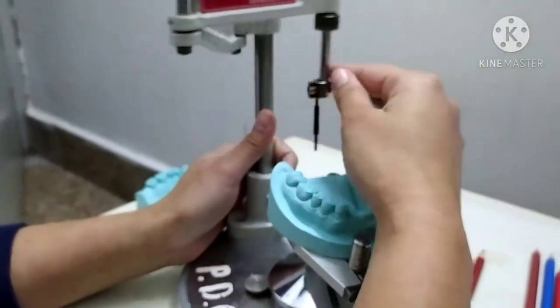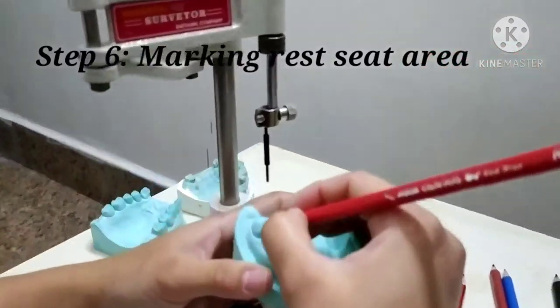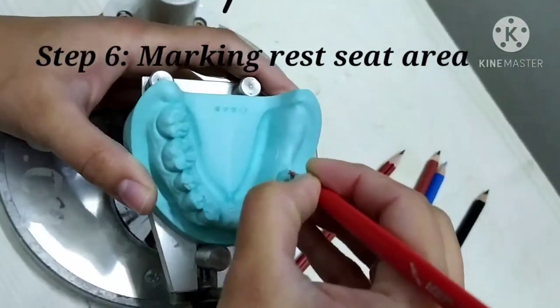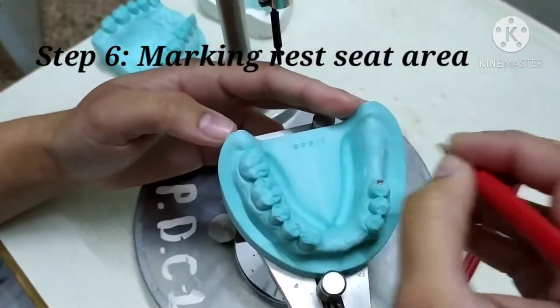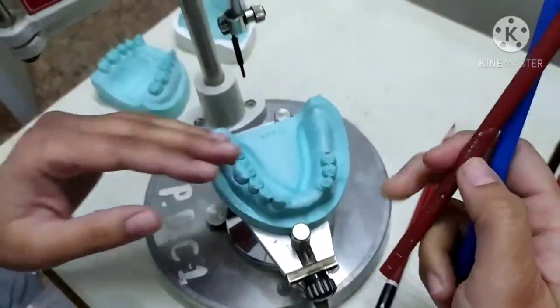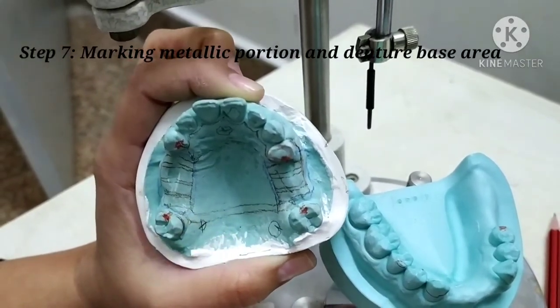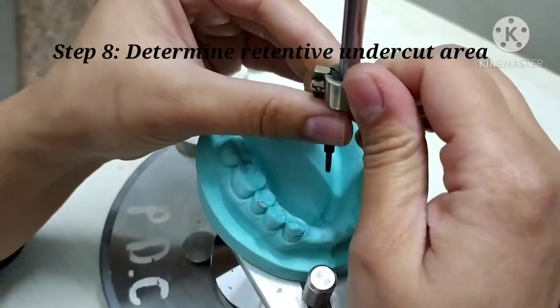Once the survey lines are marked, the rest seat area is marked with a solid red pencil. This marking must be done at the correct size of the rest seat to make it easier to design the other components. After this, the brown pencil is used to mark the metallic portions and the blue pencil to mark the denture base area. Then the undercut gauge is used to determine the undercut area — how much undercut is present.